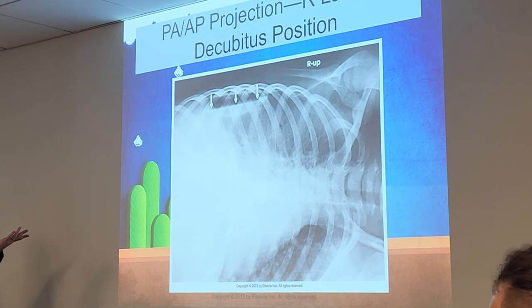There's an opposite. Your chin is down here. So this one would be a left lateral, because now the left side's down and the right side's up. Head's up here.